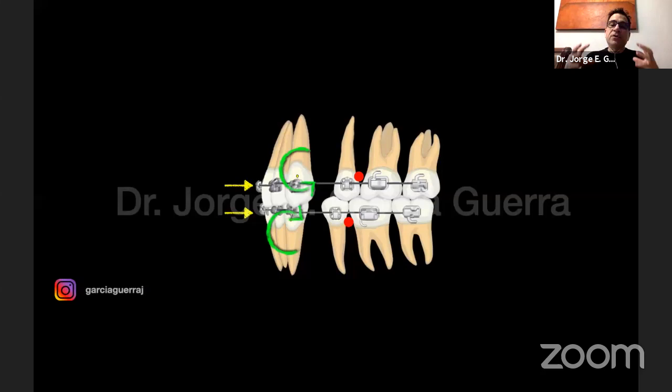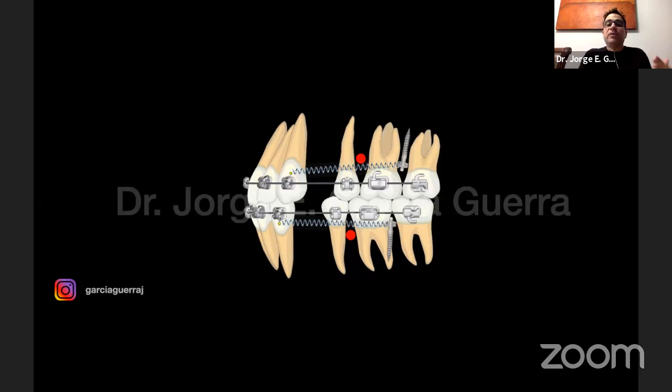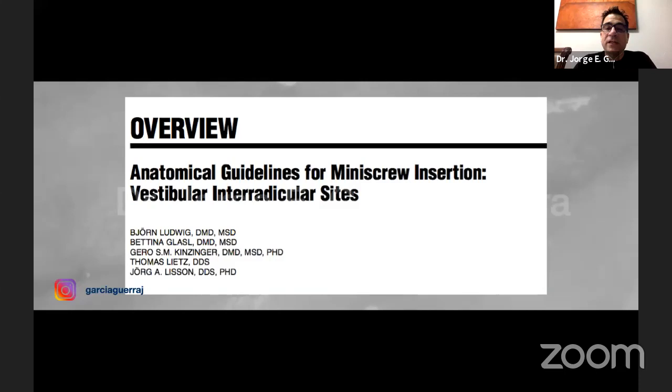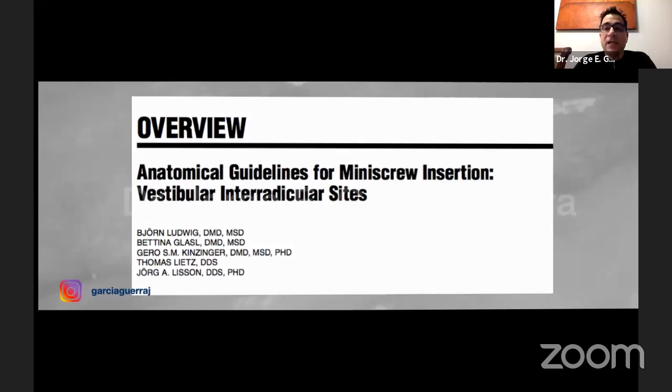So in this case, when we're doing a retraction, we need to change the direction of the force, more toward the center of resistance of the maxillary and the mandibular arch, so we can close the space better. Obviously, in these figures it looks very easy, but we must see this in clinical application. Now, I'm going to share these slides with you, and this helps us.